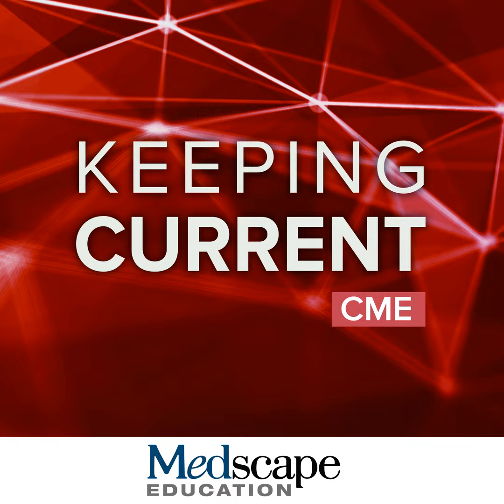Similarly, we have a small lesion, and based on initial images, we would think that this is a hemangioma, but on 20-minute hepatobiliary phase, notice that it does uptake some contrast, so we may be thinking that this is a hepatocyte-containing lesion. However, if we recognize that the hepatobiliary phase iso or hyperintensity is not equivalent to uptake of gadoxetate when hepatobiliary phase is suboptimal, that will help us avoid this pitfall.